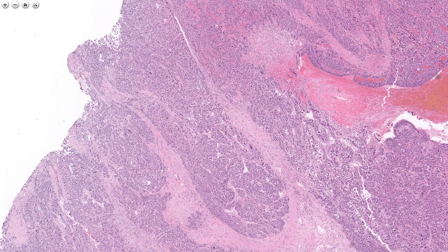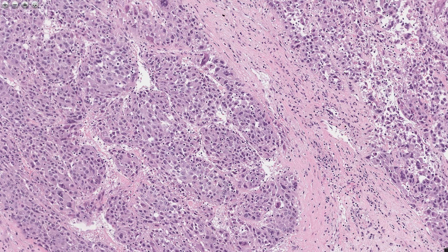Case three looks somewhat different — there are fibrous septae, but this case lacks that lamellar-type fibrosis. Almost as equally importantly, the background tumor cells don't quite look like a fibrolamellar carcinoma. If anything, it looks more like a classic macro-trabecular HCC.